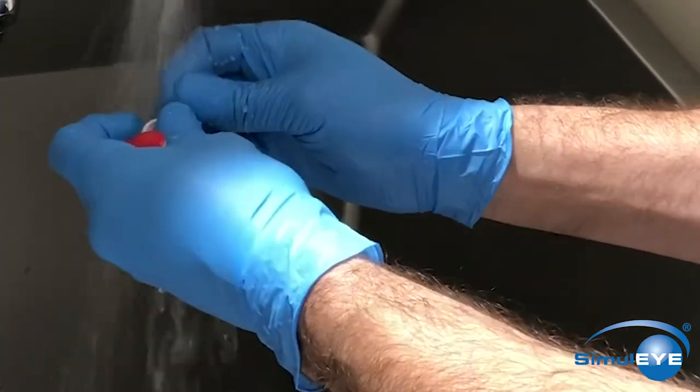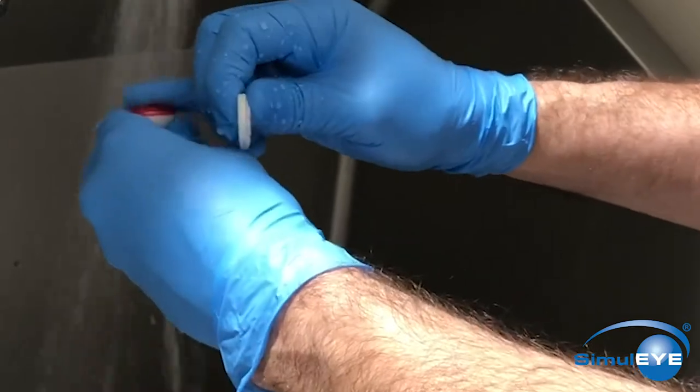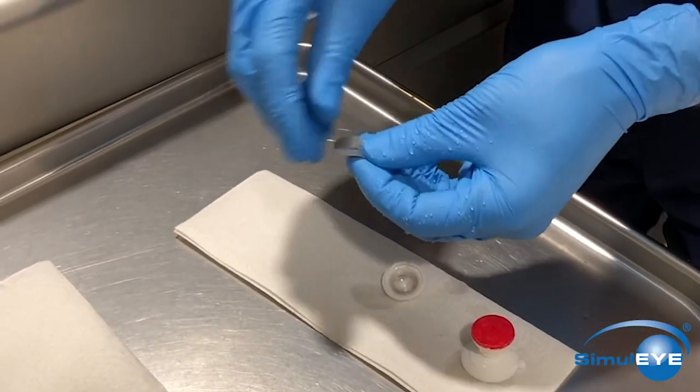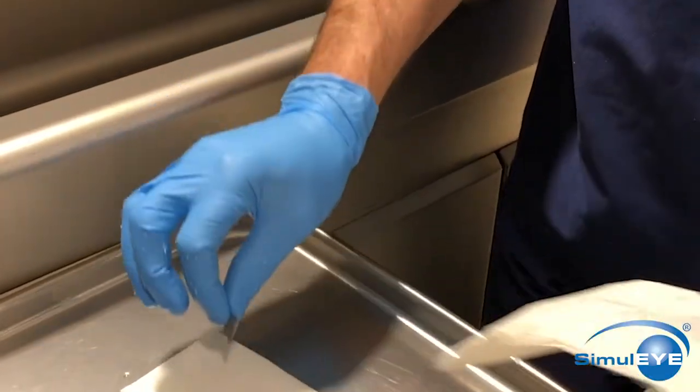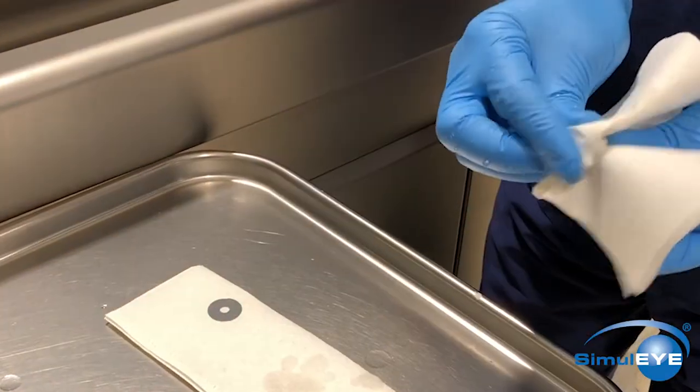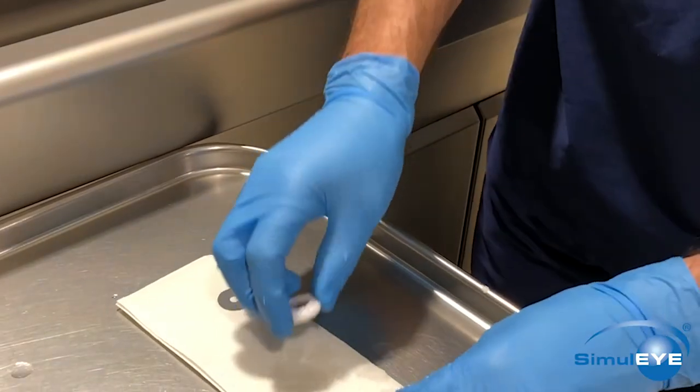Rinse them well, and then you can allow the parts to air dry, or you can dry them by hand. Once they're dry, they're ready to be reassembled, and the eye can be stored for later use.